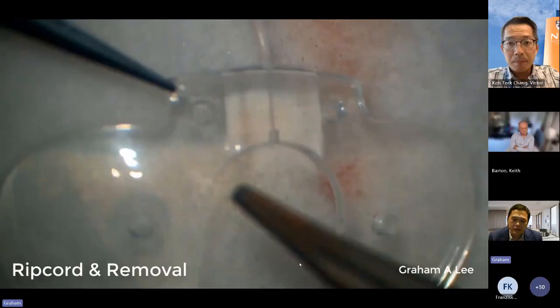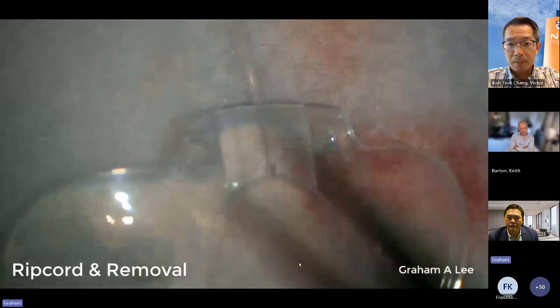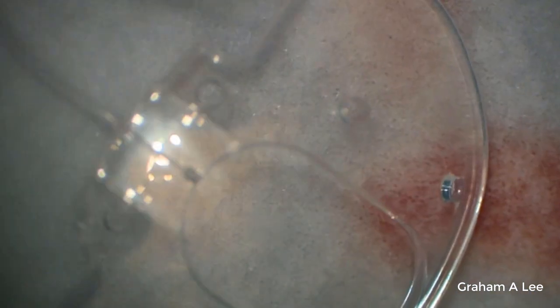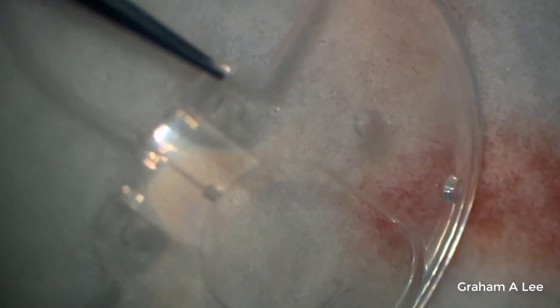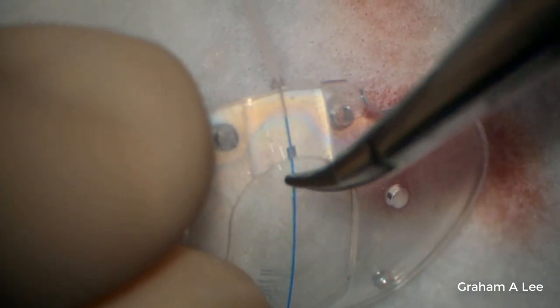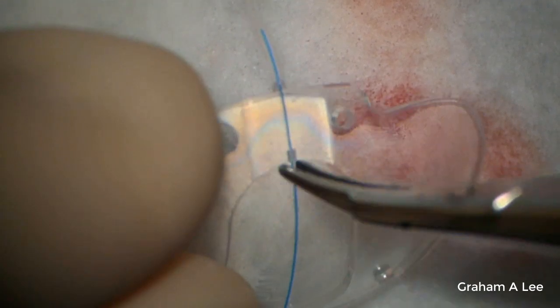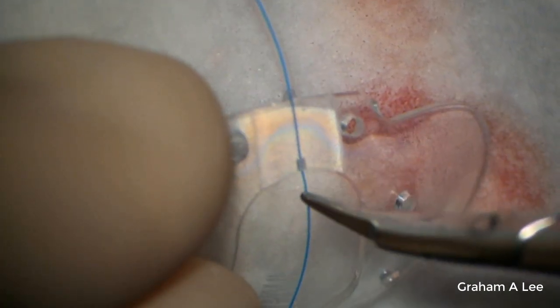So I'm going to present just a quick 2-minute video, and we can have a discussion with the panel after this. So this is using the ripcord technique, and it's a technique that I've really come to like. I take the edges off the Paul tube, and maybe this is just one of my eccentricities, but I just don't like that sharp edge. So I usually put the 6-0 Prolene down the tube while it's still dry. And you can see I have an instrument wipe just to give me some white background. And I find you can use the suture holders. It's quite a good size for this.